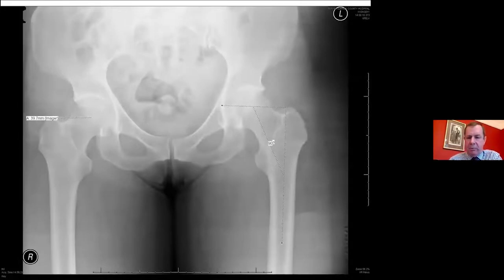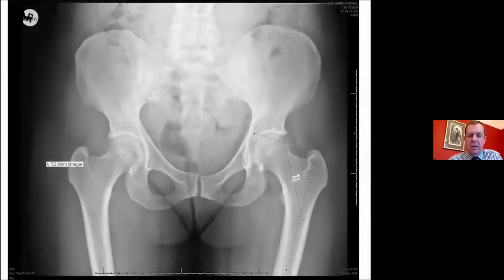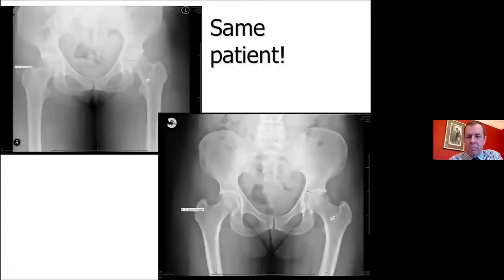This is an example of why I don't template. This is a fairly standard x-ray of a patient of mine showing fairly standard anatomy and a reasonably moderate offset. This is another x-ray showing very different anatomy with a very large offset, T plus, so the center of rotation is much lower compared to the greater trochanter. The problem is these are the same patient with x-rays taken on different days and no rotational control. Now, obviously, sizing measures and rotational control will help with this, but we're still measuring off a shadow, and I just prefer to do it other ways.